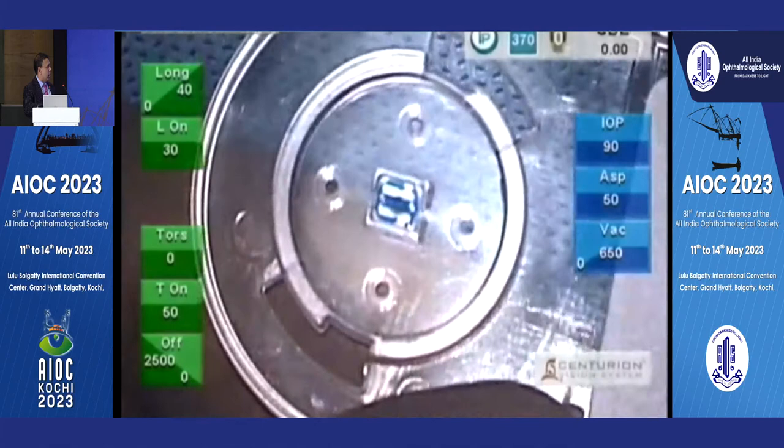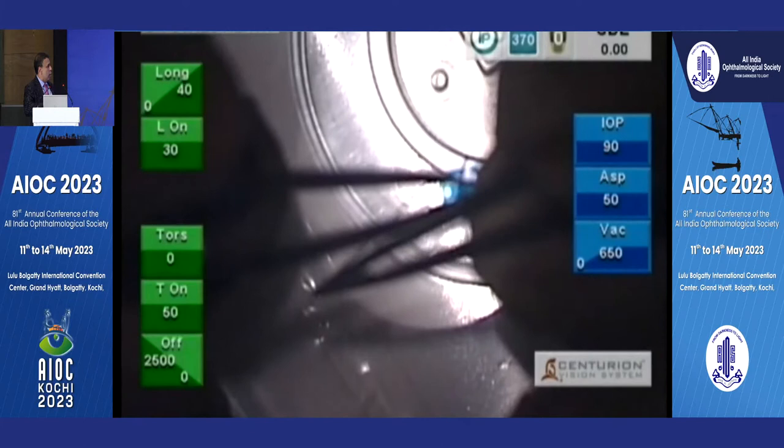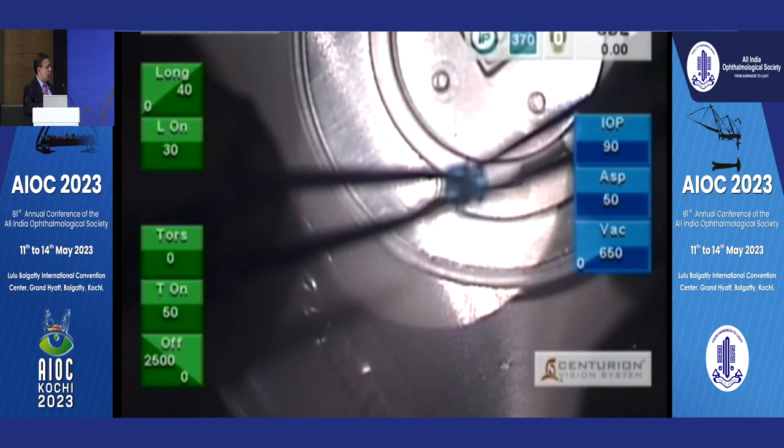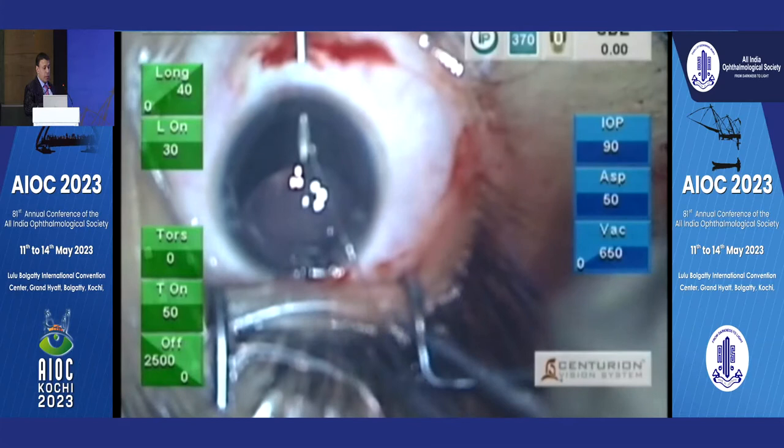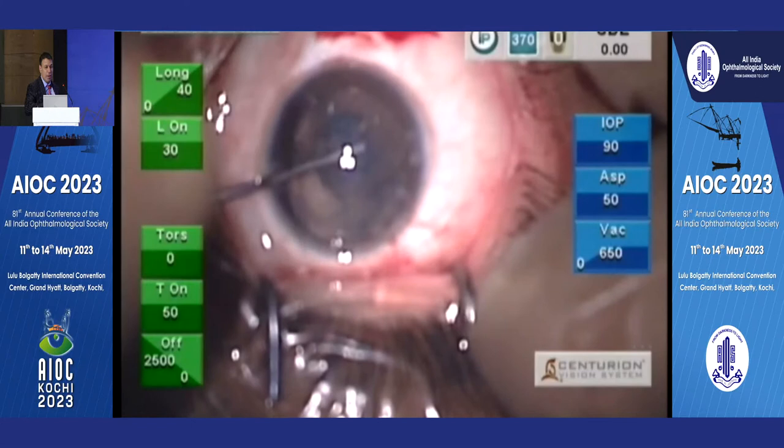So I took out this old device — it was a free sample given to me by Ehud Asia. It's called the Asia Anchor. Now they have generation two that Hanita is selling; this was the old generation one. This video is about three to four years old. You pass the suture through the suturing hook. I never thought I'd be showing this video to anyone, so it's not very good and not in focus, but he only gave me one sample so I only have one video of the Asia Anchor.